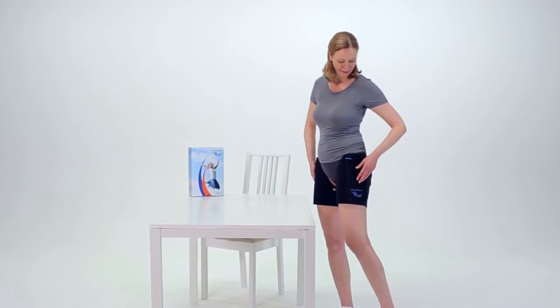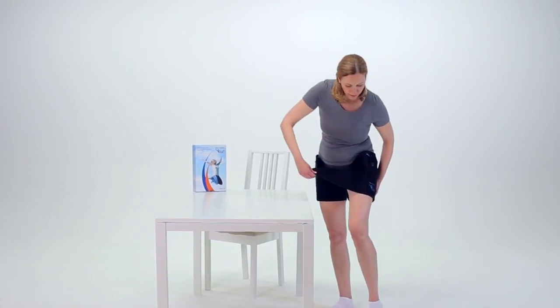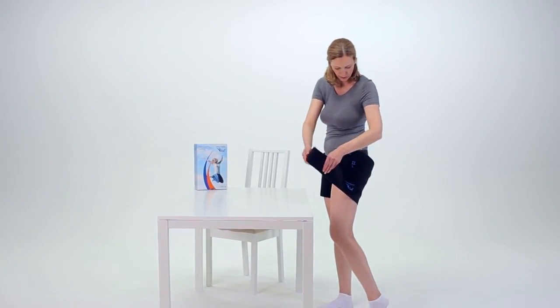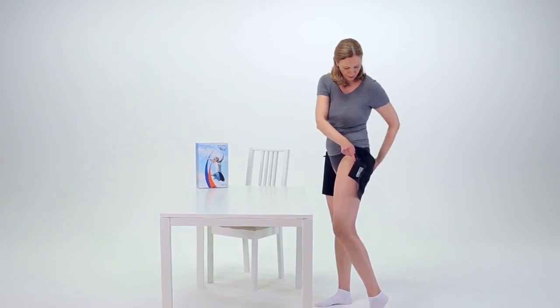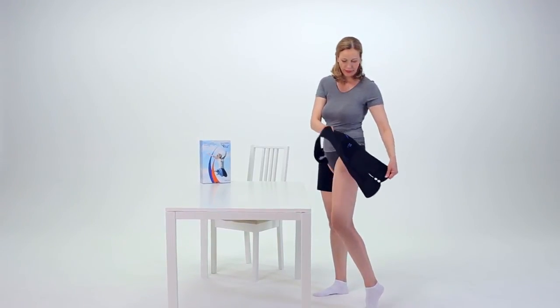Now, you can unfasten and carefully remove the garment from your left leg. First, peel the garment from the front of the leg until it is half-detached, and then peel the other end from the rear. Do the same with the right garment.